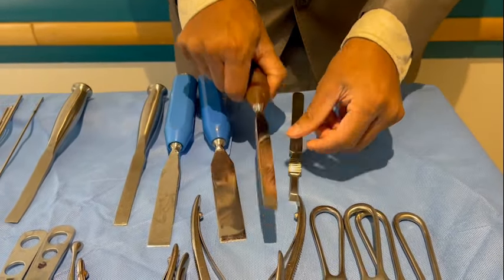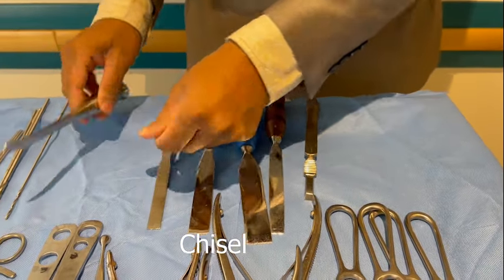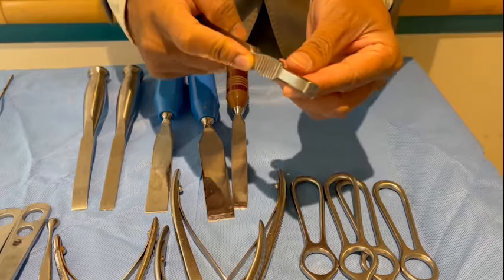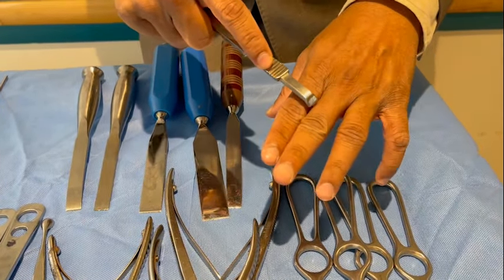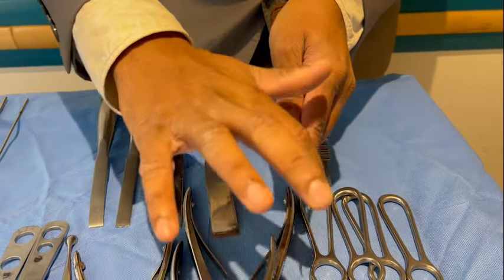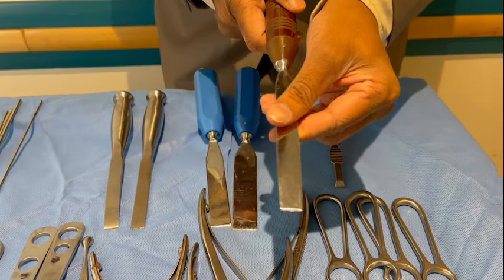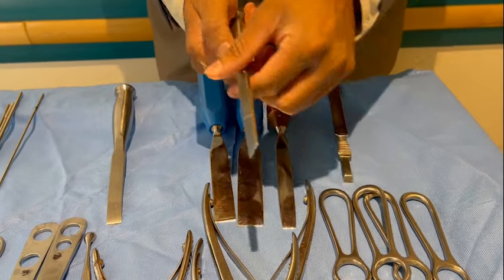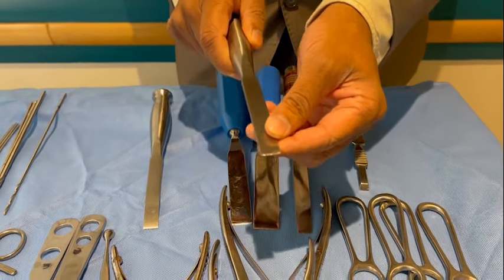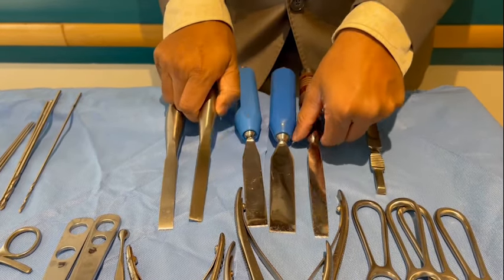This is a periosteum elevator and these are osteotomes. This is a chisel. In the periosteum elevator, you have a thumb rest — that is one way to identify it — and it is more curved. Once you have made an incision on the periosteum, you place it on the incision and elevate inch by inch. An osteotome is beveled on both sides — this is a narrow osteotome, this is a broad osteotome, and this is a medium osteotome. It is used for cutting bones. A chisel is beveled on one side only. This is a straight chisel and this is a curved chisel. It is used for taking off growths from the surface of a bone — for example, after a plate removal when you have extra bone, you chisel off the extra bone from the bone surface. The chisel is not used for cutting bone; the osteotome is used for cutting bone.